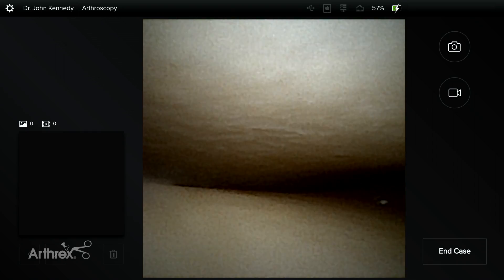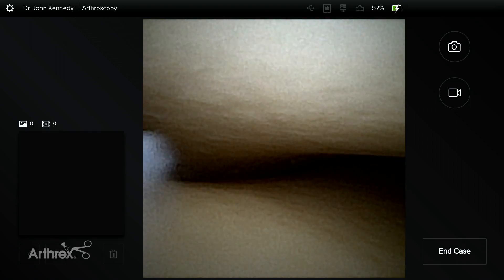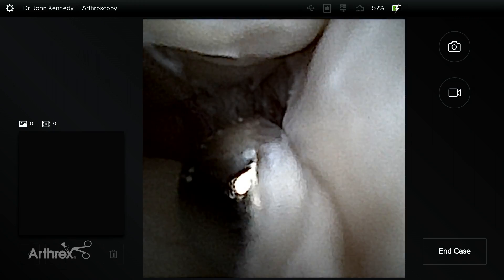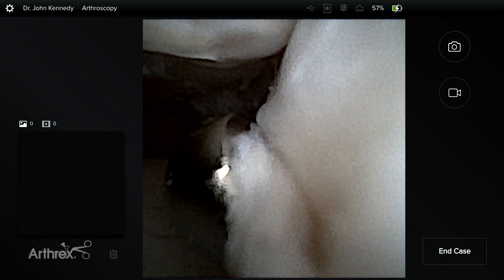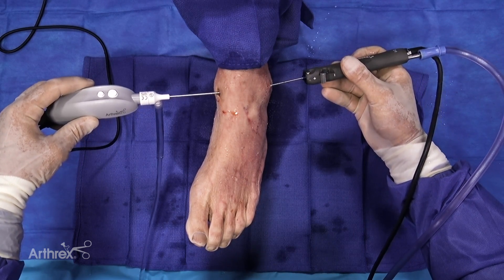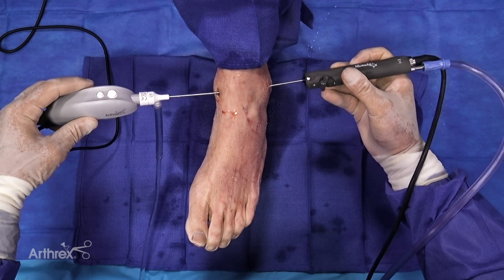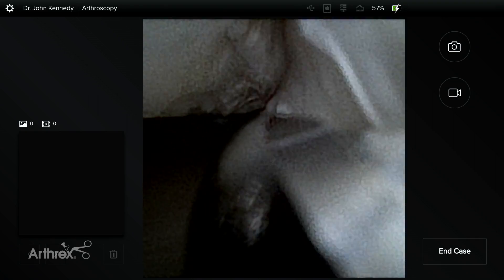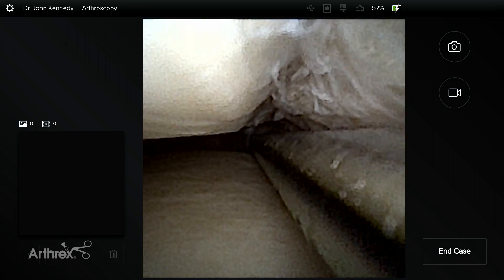Now we're looking at the midsection of the joint — all relatively normal here. And we're looking now at the very front of the joint. You can see the cicatrized mass at the front here, and we're able to resect that with our 2.0 resector — this is just clearing so we get better visualization. There is some anterolateral impingement over here, bony impingement that we'll be able to remove.